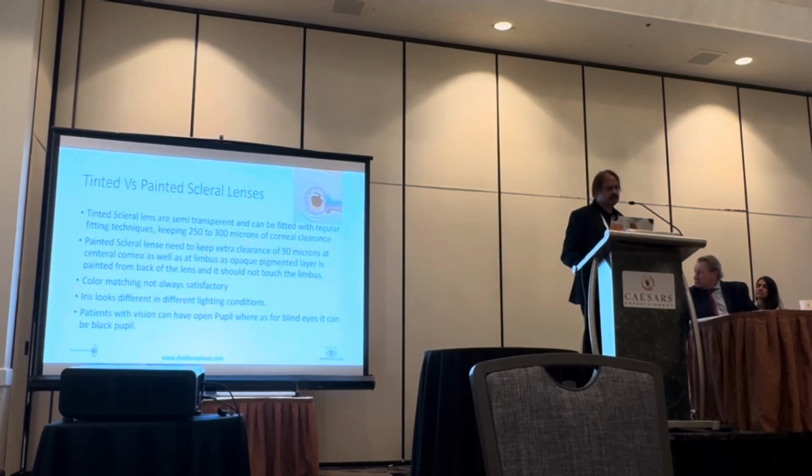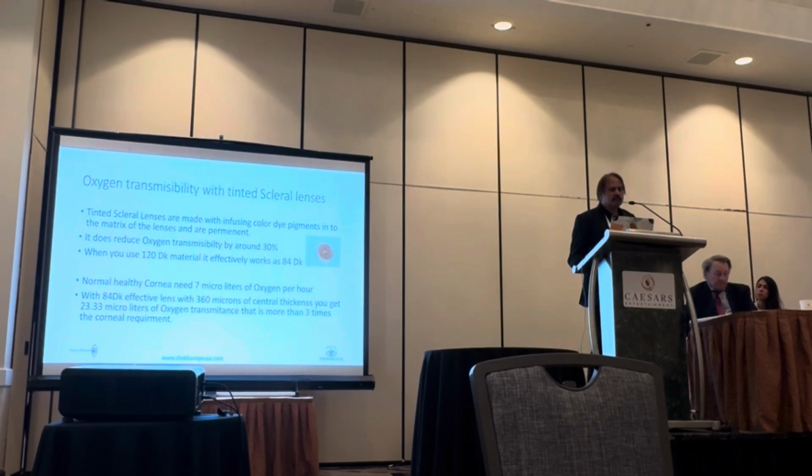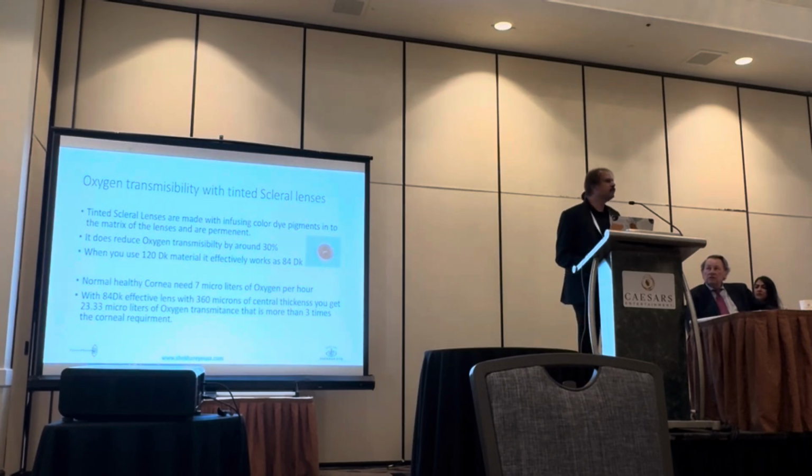But I'll talk about this more. It does work wonderfully well if you use high DK materials, more than 120 DK. When you lose the oxygen transmissibility, it is not zero. In certain papers I have studied, the cornea requires about 7 microliters per hour of oxygen, and anything more than that is sufficient for the cornea to survive.